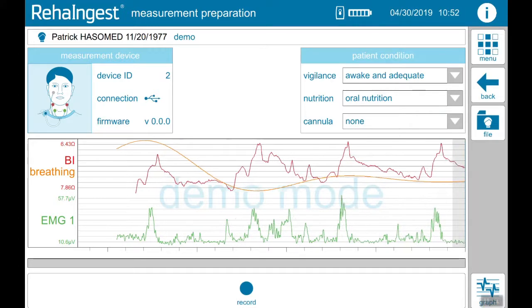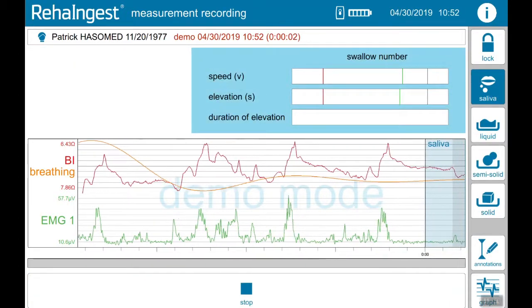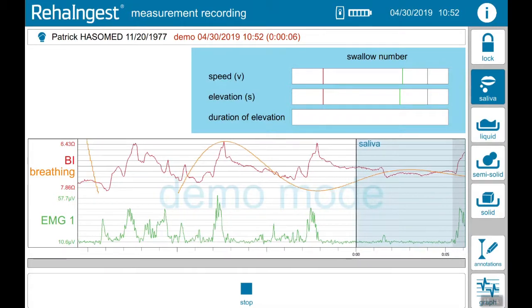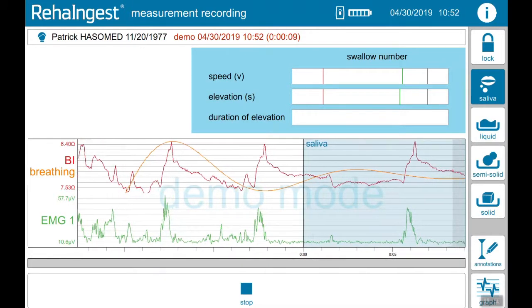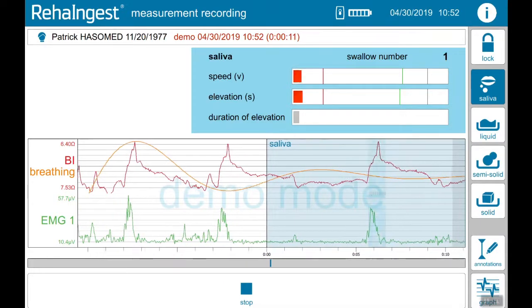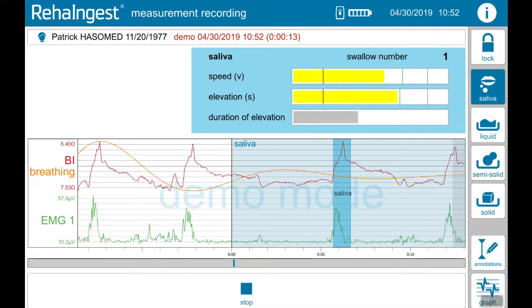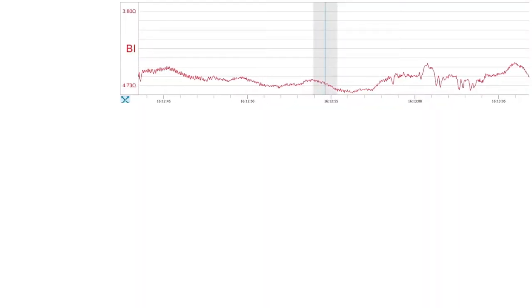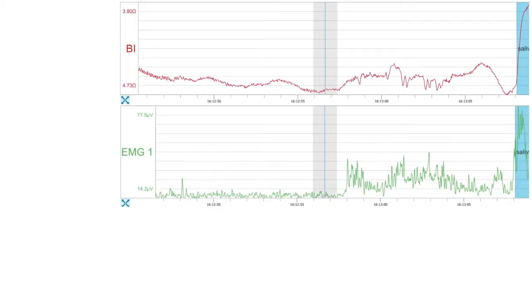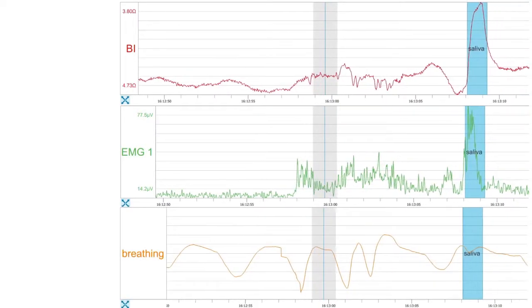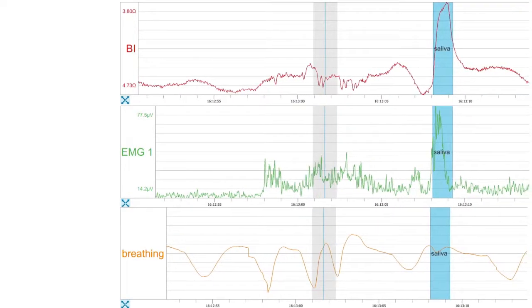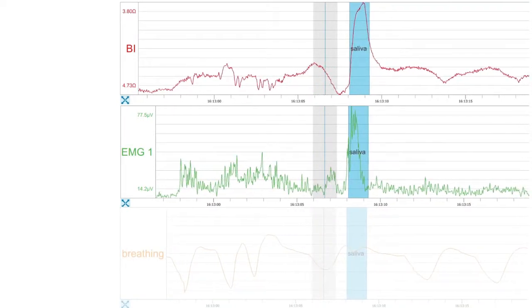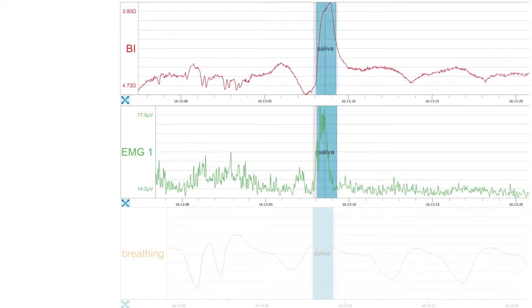After tapping record, ReaIngest starts detecting swallows automatically. The measurement can be recorded for up to eight hours. The three curves represent the measurement: the red curve stands for bioimpedance, the green curve represents EMG, and the orange curve shows the breathing. Please notice that breathing is optional and is not required for swallow detection.